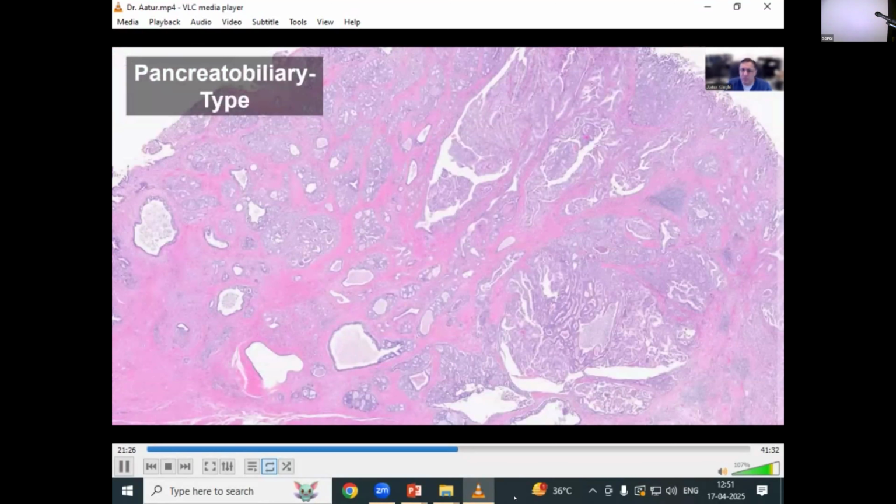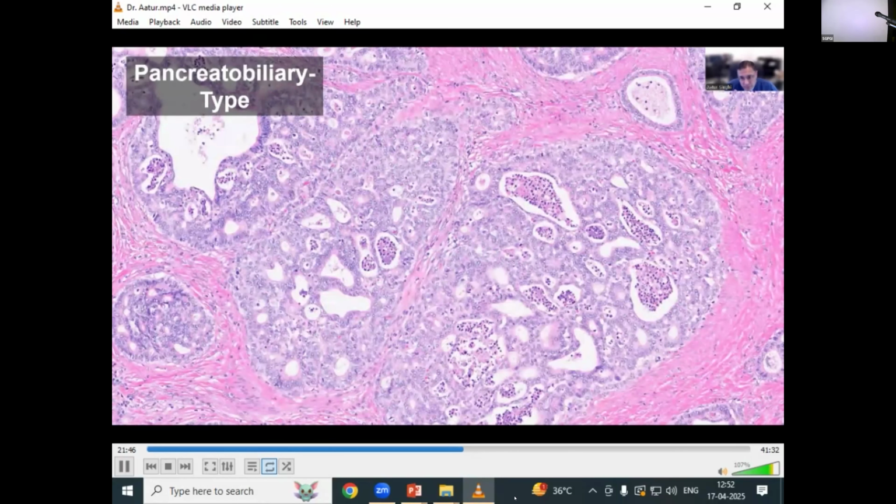In comparison, the pancreatobiliary type often arises more intraampullary and often deeper down in the ampulla itself. Again, that's where that pancreatobiliary cell type lineage is present, and it makes sense, often with the majority of the neoplasm being intramural in the ampulla itself and characterized by cuboidal but pleomorphic cells. They look uglier, forming smaller glands, complex architecture, sometimes cribriform architecture, in a background with or without desmoplastic stroma. There are many times that a pancreatobiliary type adenocarcinoma has very little stroma itself and can actually mimic a dysplastic lesion when in fact it's really an invasive adenocarcinoma.